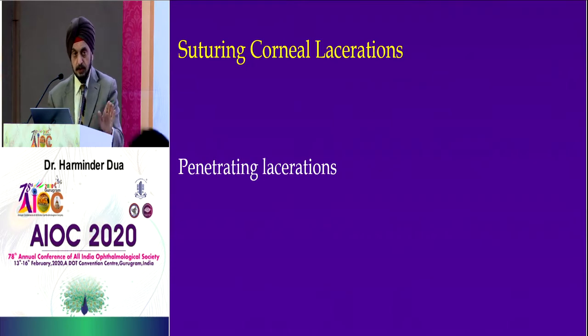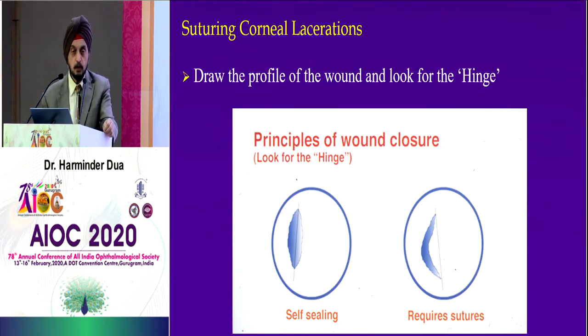Penetrating lacerations, completely different ball game. So here, when you look at this laceration, and you've done all the other things, you've examined the eye thoroughly, now you start to suture the cornea. The first thing you ascertain is the site of entry of the object into the front of the cornea, the epithelium, and the exit into the endothelium. So where it has gone.